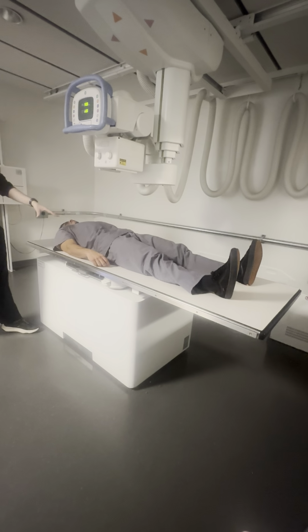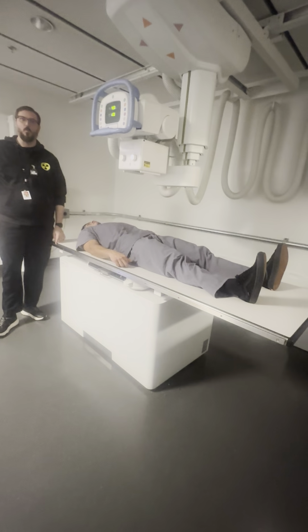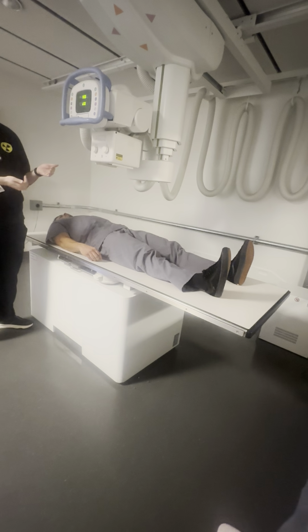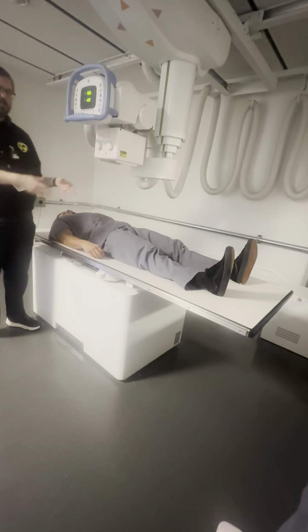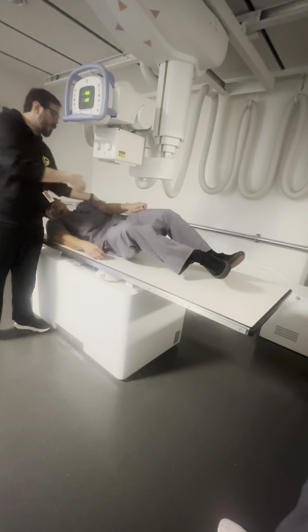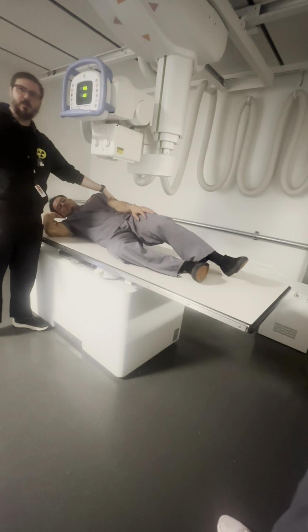Now, we don't leave our patients like this the whole time. Who's done a small bowel series? What do you guys do with your patient? Let them walk. Walk them around and stuff, right? At the bare minimum, what you should do is turn them onto their side. You're going to do your images flat, but when we have 15 minutes where we're going to sit around, you want to turn your patient to their right side. Put pillows, wedges, something underneath them to hold them up. Not fully lateral, just like this, right?